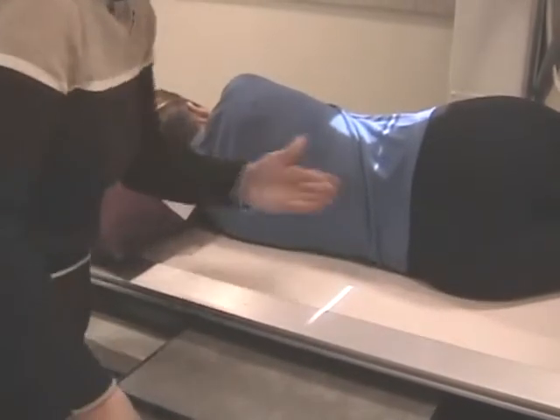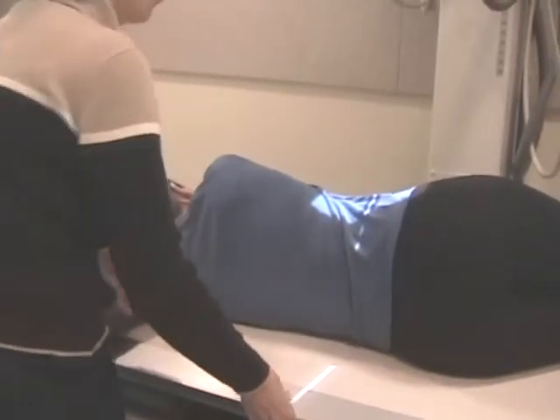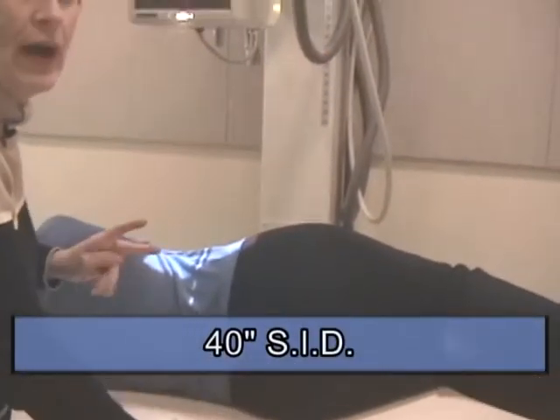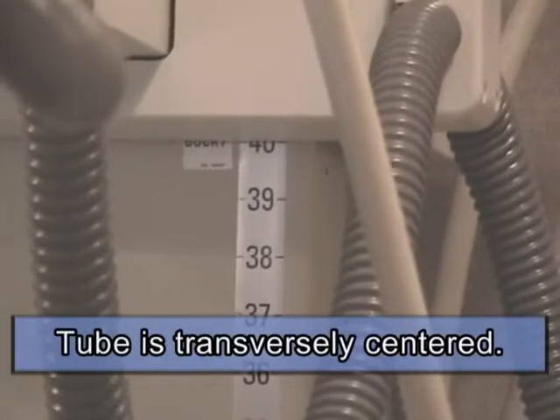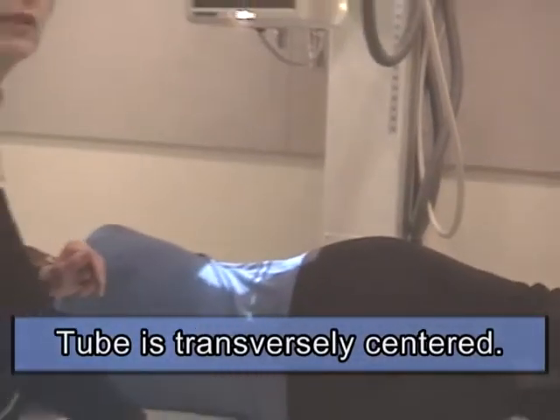Tube and the film remain centered, so all I have to do is float my tabletop. And I do have 40 inches. I've had 40 inches throughout. I forgot to tell you that at the very beginning of the procedure. But we have 40 inches to the bucky. And the tube is transversely centered. Okay? Don't forget, tube should be transversely centered.